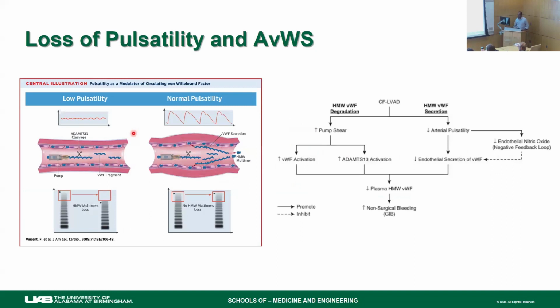So this is really a summary of the paper. What they were able to do, and what actually enabled this study, is this is a swine model, but you have these small catheter-based pumps that you can insert into the ventricle or into the aorta, and then you can pump blood using those pumps. So they use that to introduce continuous flow within the circulation.